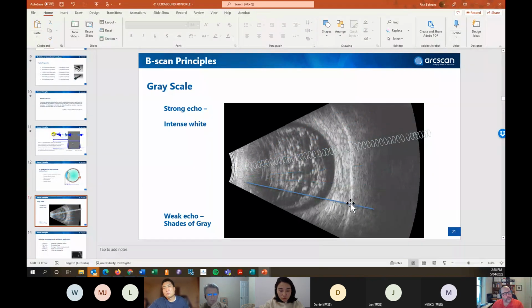Rick, if I can correct you, please. I was about to go there. Okay. We have the ability to move the base of the plate in different positions. So the probe, generally speaking, will move in an arc. If we want to move the probe in an axis, like up and down or vertical, we have the ability to do that.